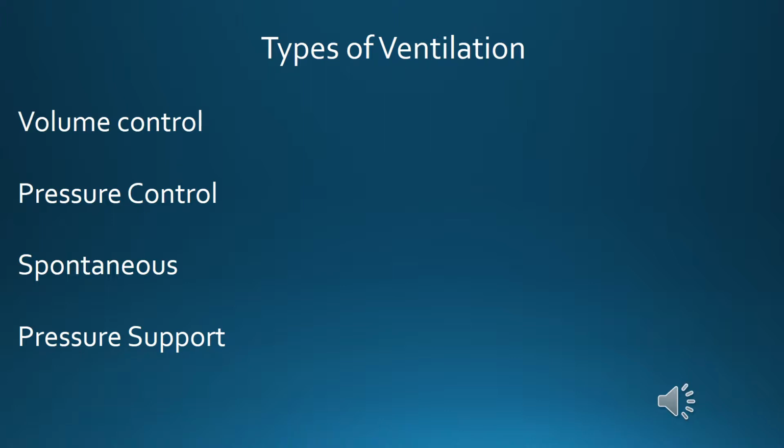The best way I describe pressure support is if you're lifting weights and you reach that failure point on a bench press and you can't quite get the bar off your chest. Imagine that's the patient that's intubated with an endotracheal tube in their airway. They're struggling that little bit. It's effort.